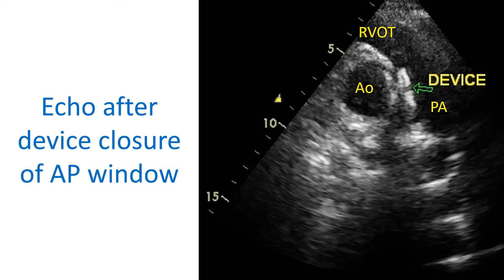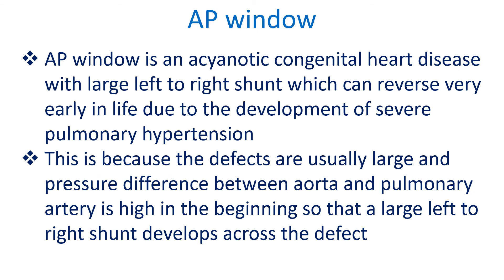Echocardiogram in parasternal short axis view showing a device closing an aortopulmonary window. The circular shadow to the right of the device is the cross-section of the aorta, while the semilunar shadow to the left is the right ventricular outflow tract and pulmonary artery.